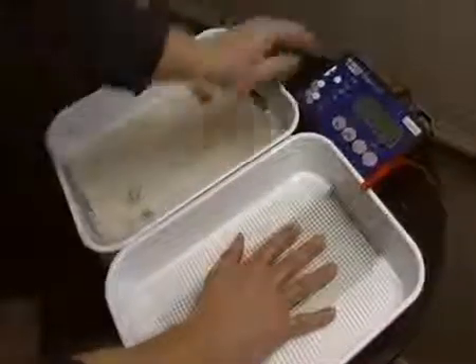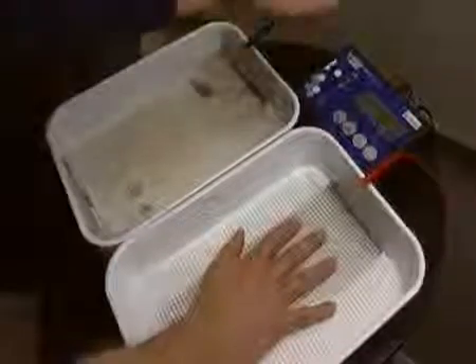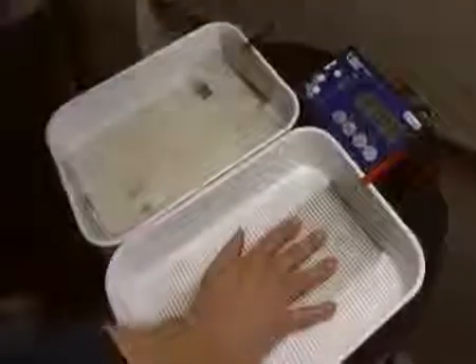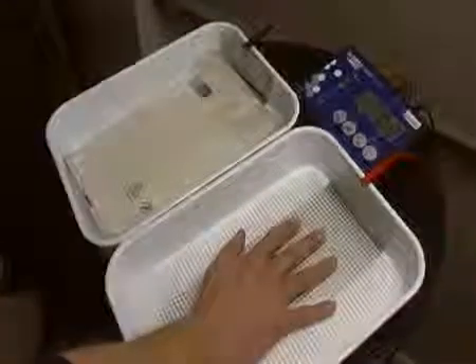Pour in some warm tap water and then, when you're ready to go, place your hands or feet inside the trays. The machine will register that the circuit's closed. It'll do its skin conduction test, make sure everything's okay with the set parameters, and it'll automatically start to deliver your current.